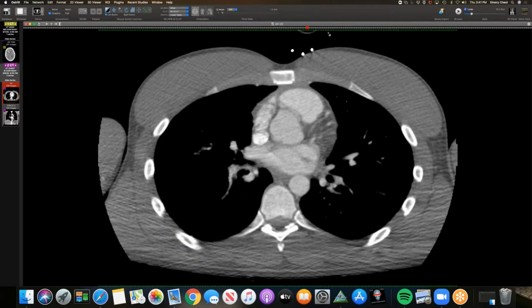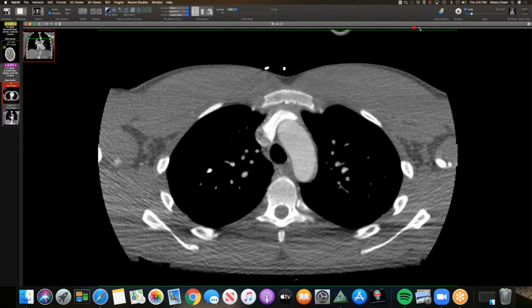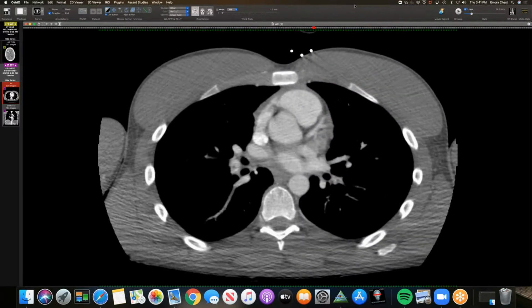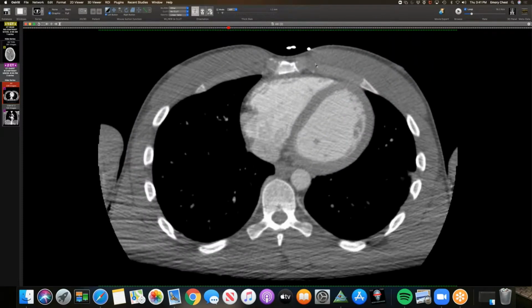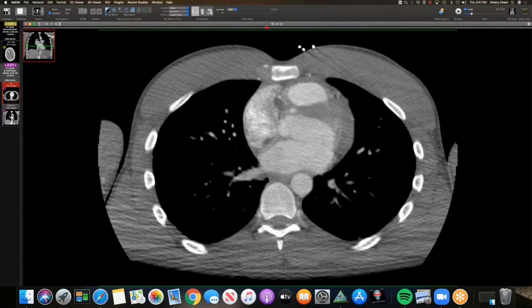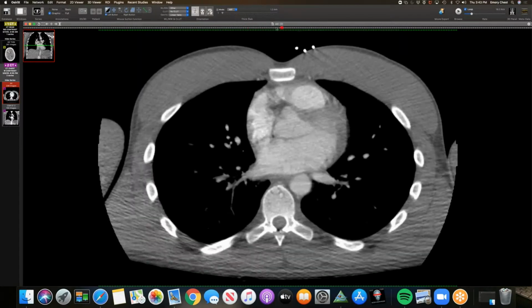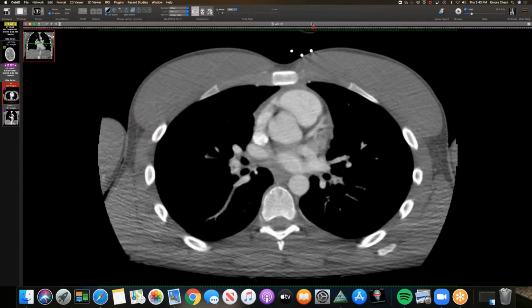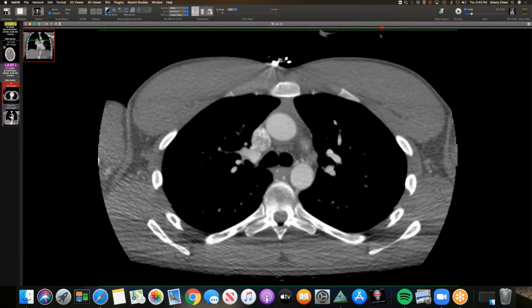So this is pretty classic, I thought, some classic findings of CTEPH. He had some on the right side, trying to find them. Right there, for example, some thin fibrous web-like filling defects, a little bit on the left. Could you see a PFO? I don't think so. There's too much motion. I thought the parenchymal hemorrhage in the brain was from his Eliquis, but I'm not sure. He has some large bronchial arteries, basically the findings of CTEPH, and some mosaicism.